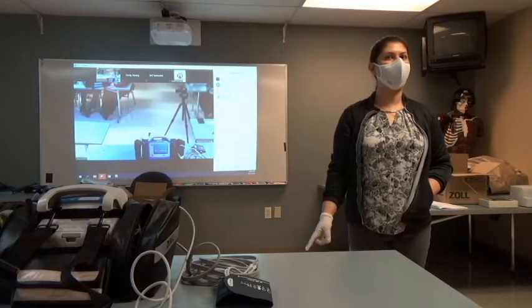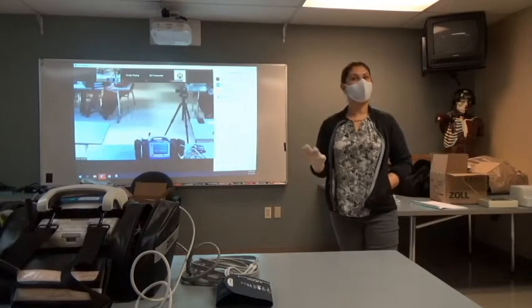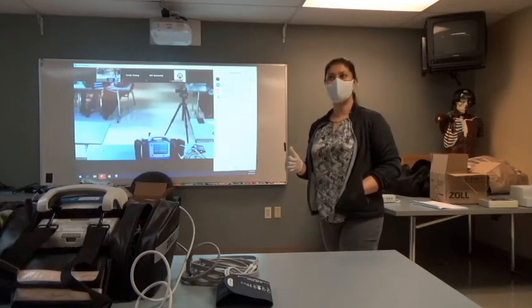Okay, now how do we get out of AED mode? Exit. Yep, there you go. And then everybody's comfortable going into pediatric mode? Yes. Okay. Do you guys have any questions for me about the analyze button?